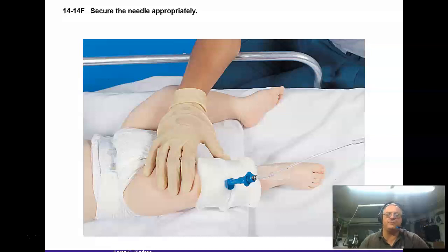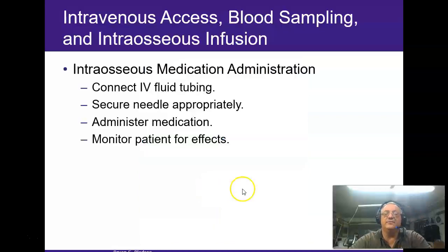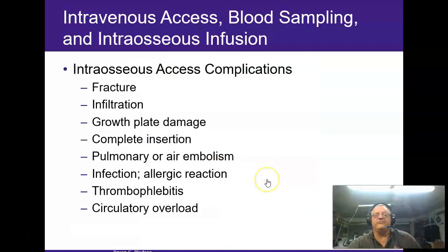Make sure that you secure it properly, guys. Usually we use a pair of small gauze rolls on each side. So make sure that you secure it properly. Good news is Easy IOs, they secure, they're pretty much, and even the Jamshidis here. These guys are usually, once you have them in place, they stay put. Okay. The biggest thing is you don't want to knock them loose. The Easy IO is really hard to knock loose. But again, then you can give your medicines. And actually, usually what I will do is I'll put a 3-way stopcock here. So if I need to give them push medicine, I can give it through that way. And again, remember, anything that you can give through IV, you can also give through IO.